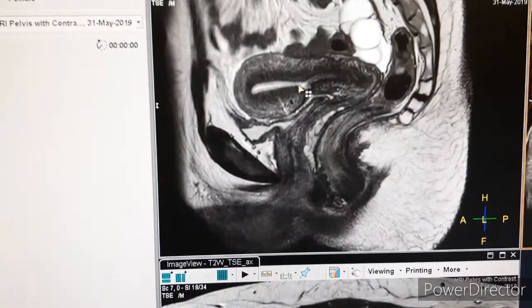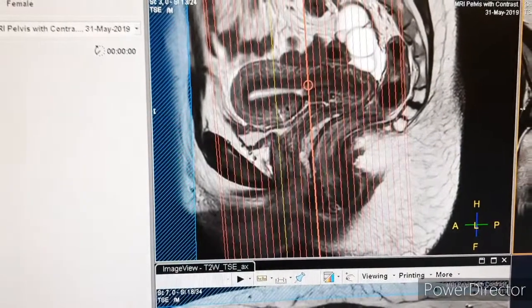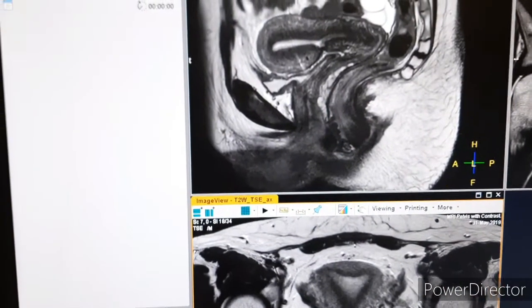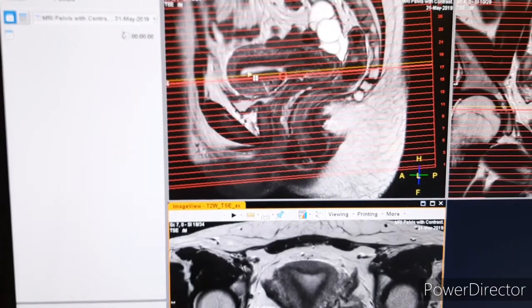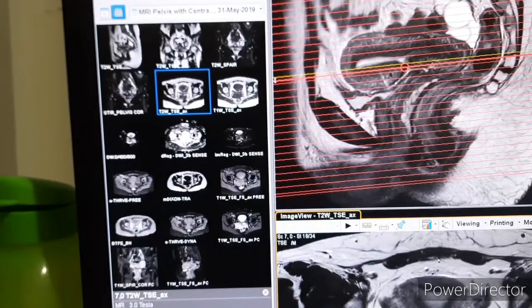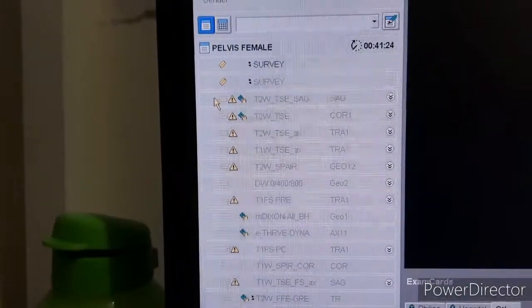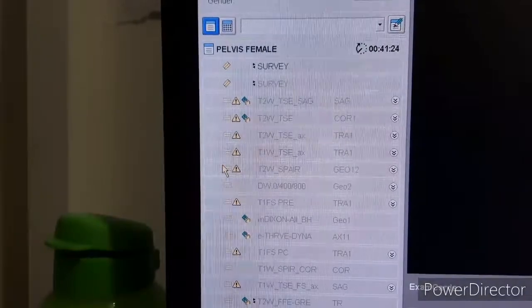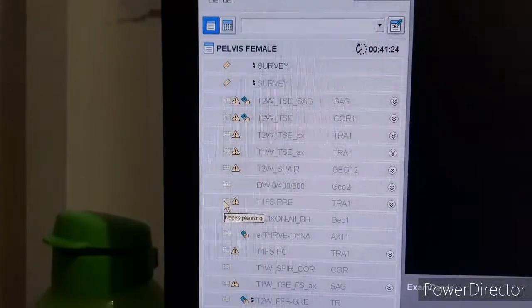Then according to the reference line — here I want to mention that the reference line is the endometrium, which you can see here. According to the endometrium, we have to take coronal and axial. You have to follow the reference line here according to the endometrium.